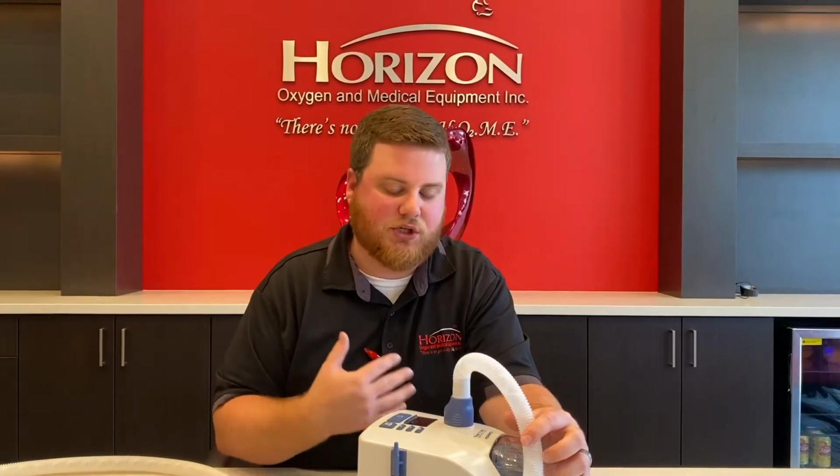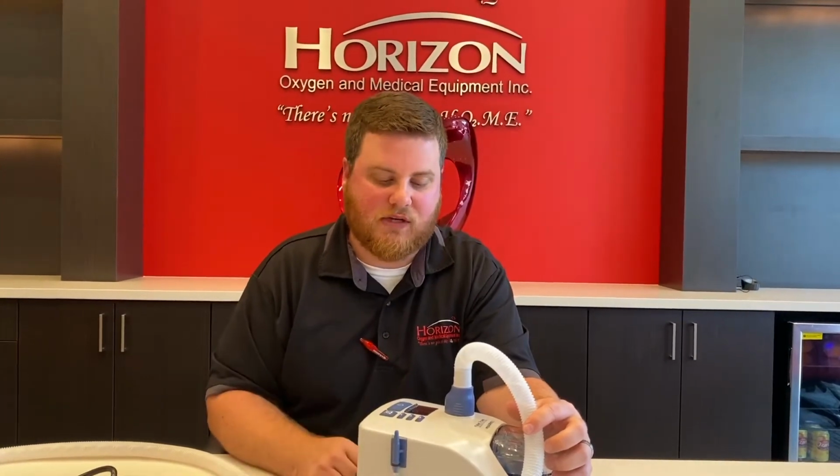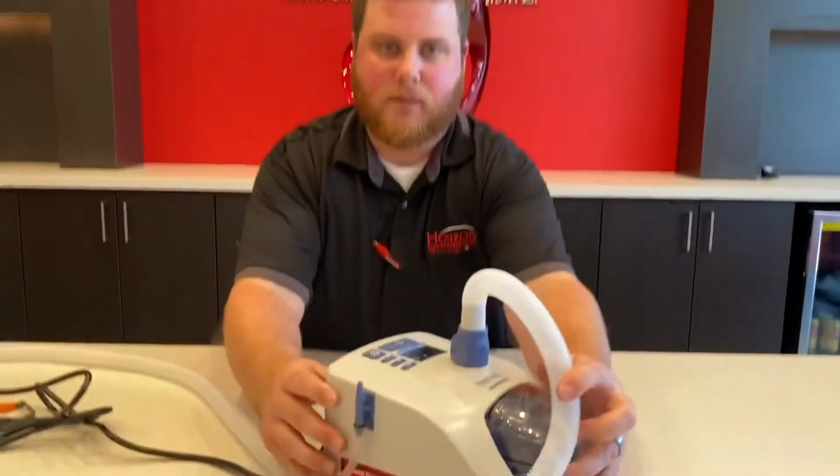Before we do any setup, we always disinfect the machine before we deliver it, and we of course also set whatever settings we receive from the physician. Now this machine always takes a minute or two to warm up, so it's important just to give it enough time. It'll show a little circle that's spinning around, so you know it's thinking, and eventually it'll show this screen.